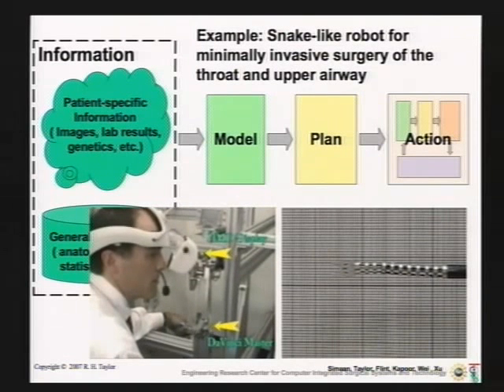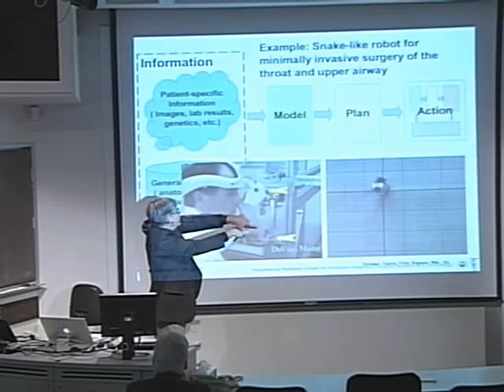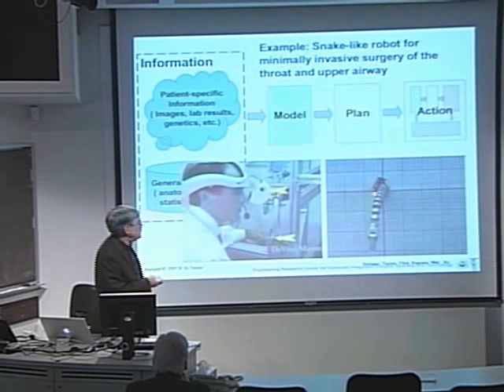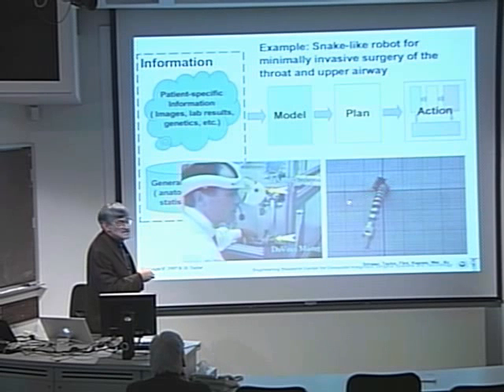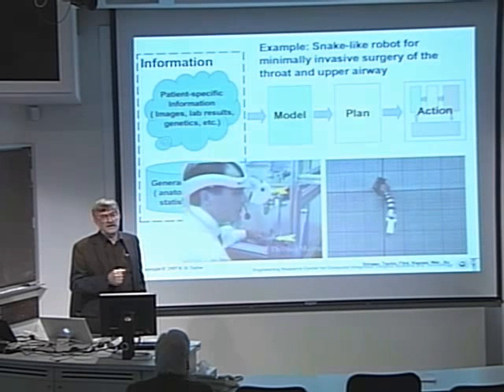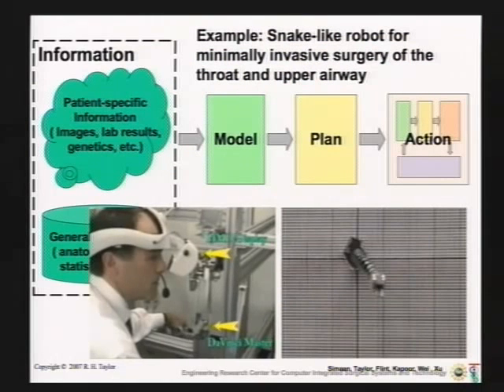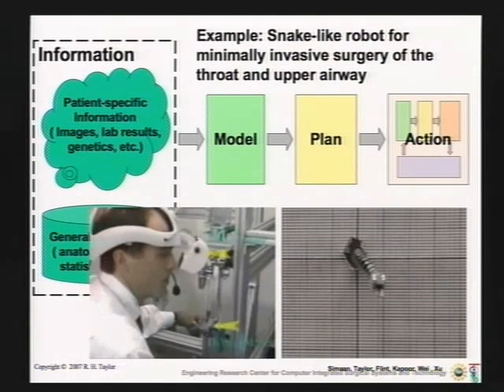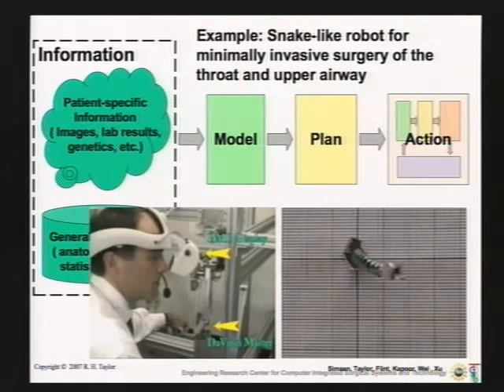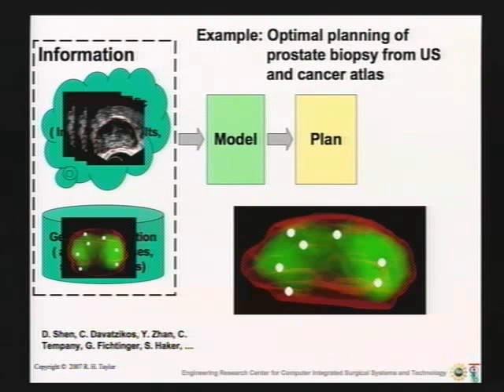Now, if you have 2 spines, if I push on my top and pull on the bottom, I'll get bending. And if I do it the other way, I can't bend my fingers back. With 3, you get bending in 2 directions. So what we have here are 3 tubes, and that gives us 2 degrees of freedom. And running through each tube is a little rod, a little wire. So we have 4 degrees of freedom right down in the wrist. This one is 4.2 millimeters, but we believe the design is readily scalable, certainly maybe to 2.5 or 3 before you really begin to worry about scalability. And then there's just, in this case, a very simple gripper. Whoa, what happened?